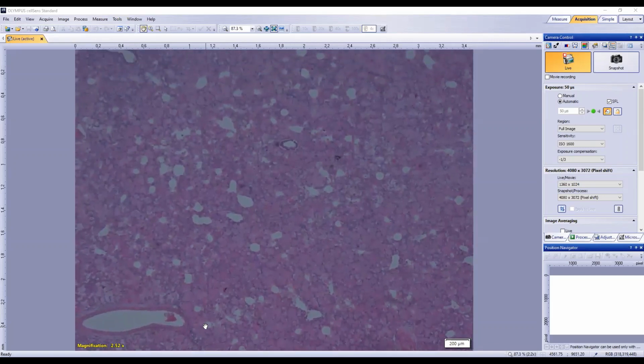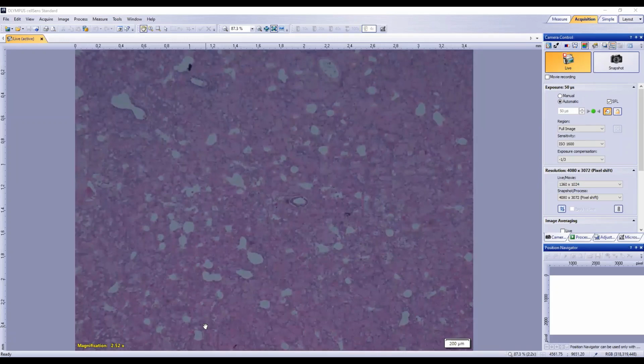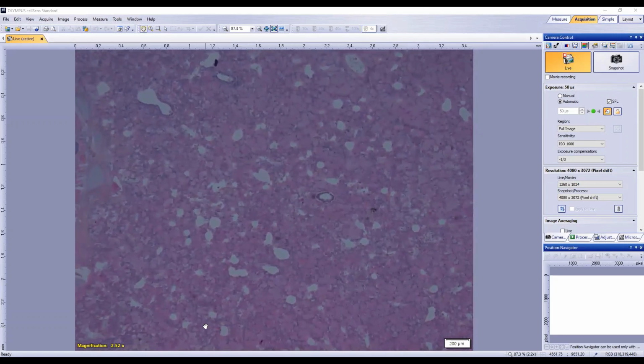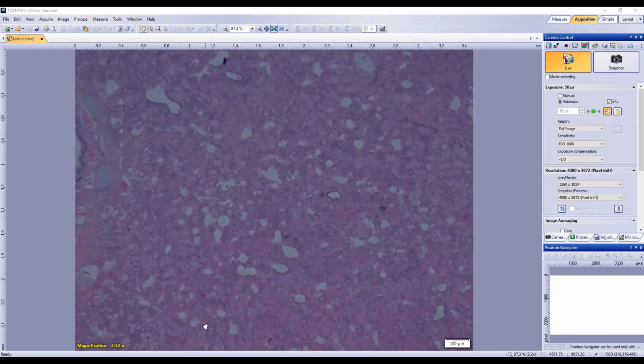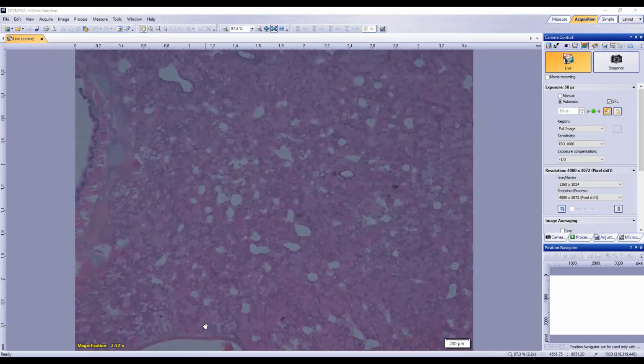Moderately thickened. Yeah, yeah. In some places they're ruptured. So that leads us down a path, but we won't go too far down that path. If we're seeing ruptured or disrupted alveolar septa, that leads us down another path.